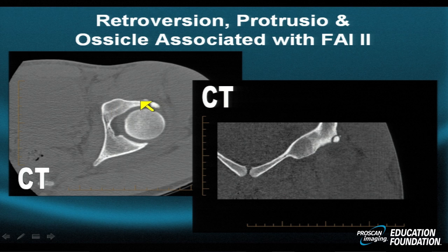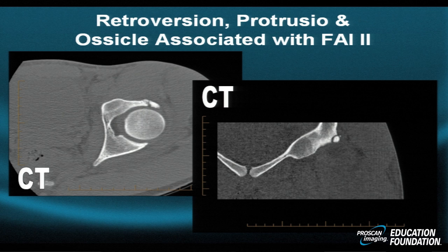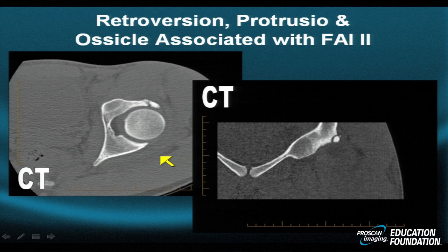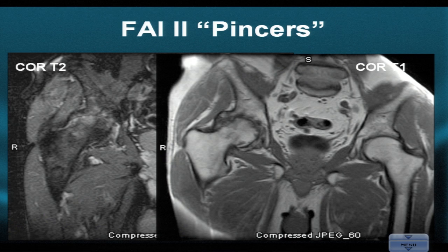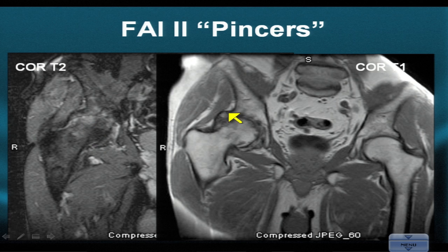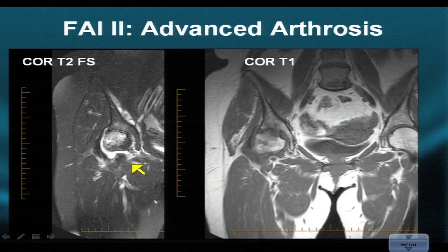The ossicle may contribute to acetabular retroversion. The anterior column of the acetabulum is more lateral than the posterior column, forcing the femoral head posteriorly into a posterior rotated position — the phenomenon of retroversion — and the cup is too deep, achieving acetabular protrusion. The two pincers are seen wrapping around the femoral head in the axial projection. In the coronal projection, severe advanced osteoarthritis is evident with complete loss of cartilage, bony sclerosis, osteoedema, erosions, and large pincer crab claw spurs superiorly and inferiorly, with severe premature unilateral osteoarthritis of the right hip compared with the left.